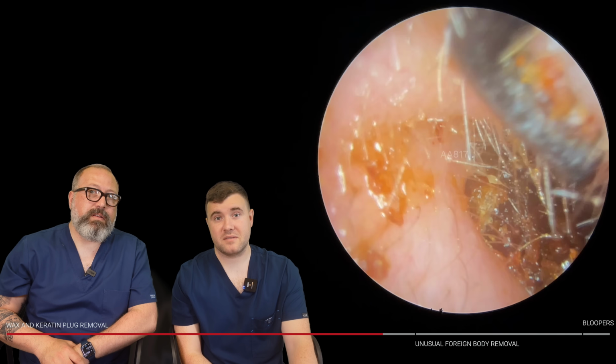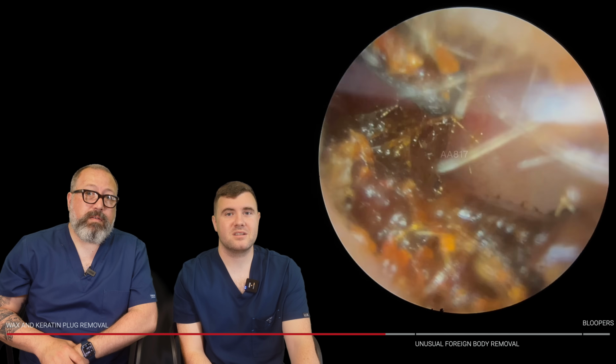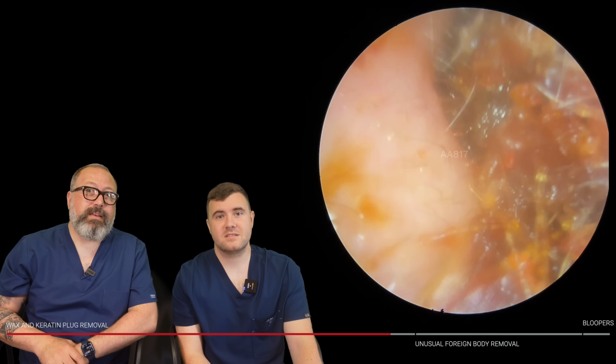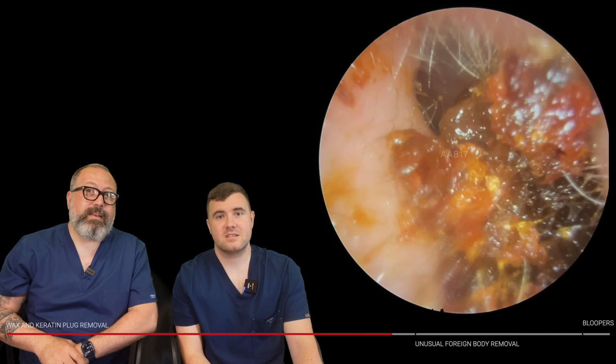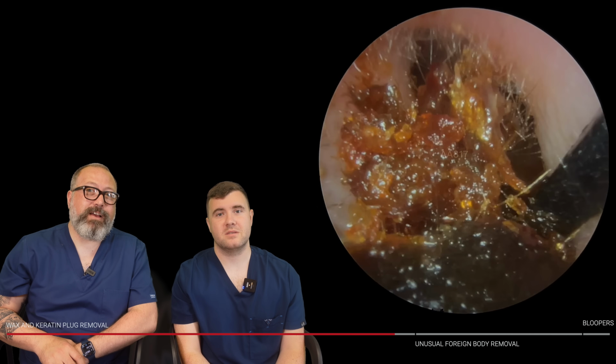It surprises us half the time. You look in the ear, kind of think, oh yeah, it looks like there's a lot in there, but then you don't actually realise how much is actually in there. There we go. Oh, nearly. It's on its way. It's nearly there. There we go. Out that comes.